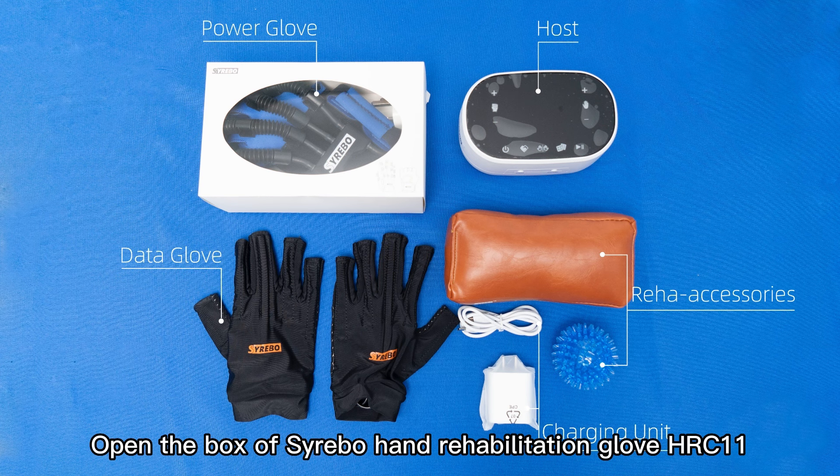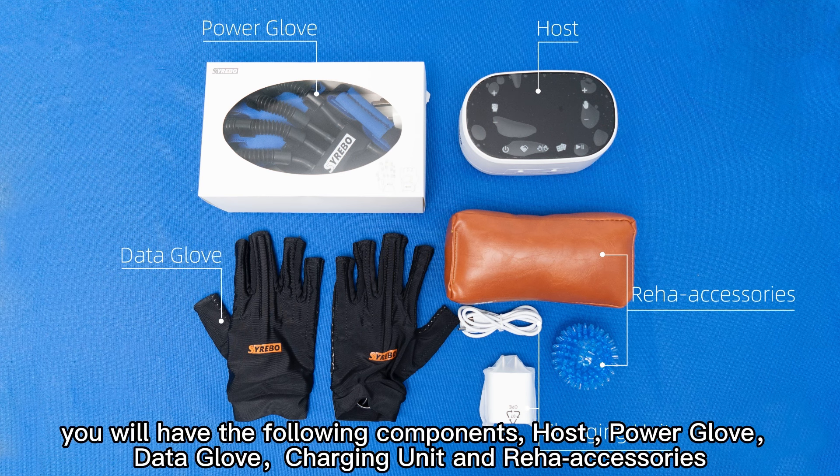Open the box of the Syrebo Rehabilitation Glove HRC 11. You will have the following components: host, power glove, data glove, charging unit, and rehab accessories.